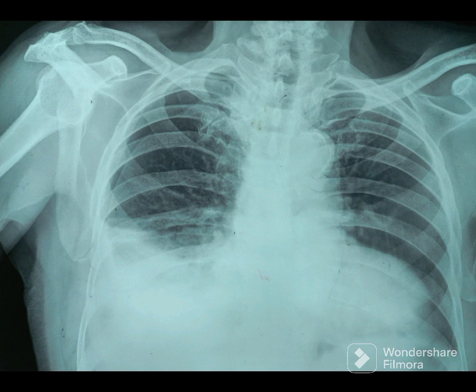You can also see the pleural line of the lung in the lateralmost aspect. There is a thin rim of area where there are no bronchovascular markings, and then you can see that lung margin which is called the pleural line.